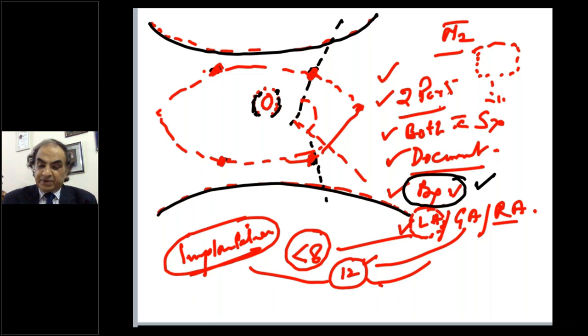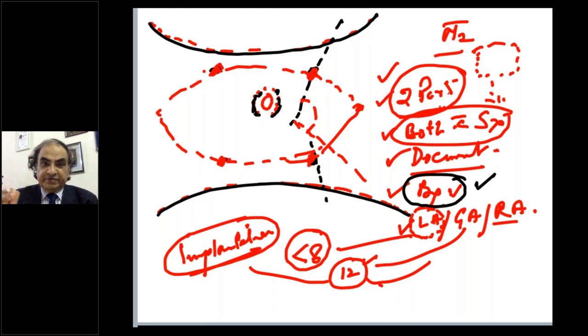So I'm repeating it. It's mandatory to have the clinical diagnosis imaging based, two ports at minimum, otherwise it won't be diagnostic laparoscopy, it will be celioscopy or peritoneoscopy or whatever what have you, or simply laparoscopy. Both are to be held by the surgeon at least when searching. Now when you found a golf ball in the bush, then you can give the torch to your friend to fix it there, then you can remove it. So when you're intervening, you can pass on one stick to the other.